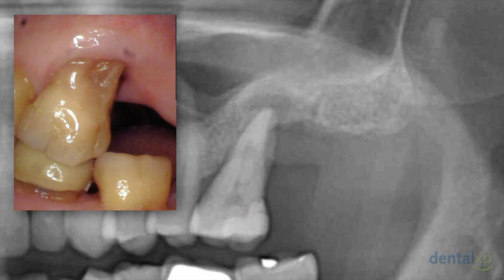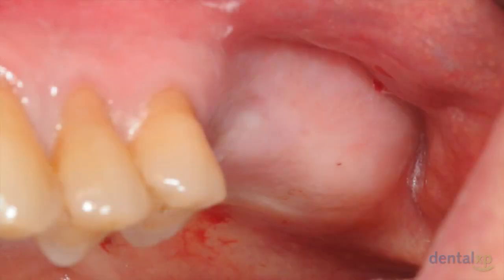So here's a patient who presented with severe periodontitis involving tooth number 14 and missing tooth number 15, lost earlier for the same reason. The tooth was extracted and then simply allowed to heal to regenerate soft tissue and achieve a healthier local tissue. And here's the patient at 3 months with a broad alveolar width and an arch deformity at number 14, 15 sites.